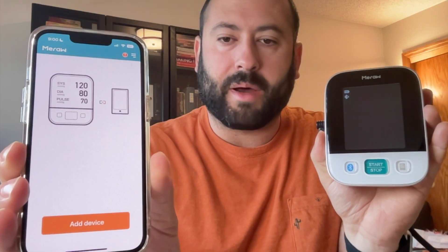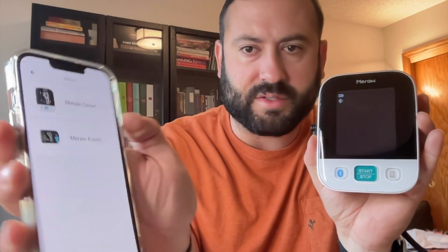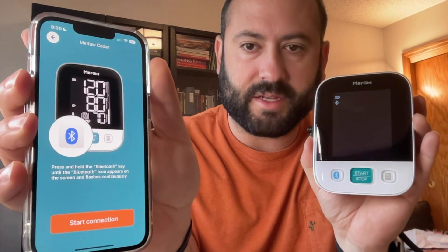Then what you want to do is grab your unit and press that Bluetooth button — now it's blinking. Go to your app and click that bottom button, which is Add Device. It's going to ask you for different models. I have the Cedar model, so I'm going to click Cedar and then it'll say Start Connection. I'm going to go ahead and click that.